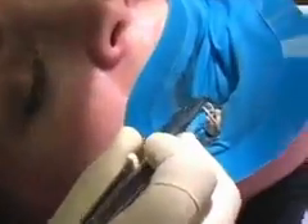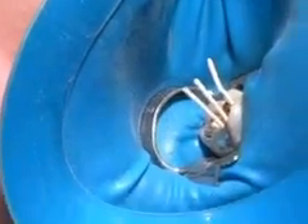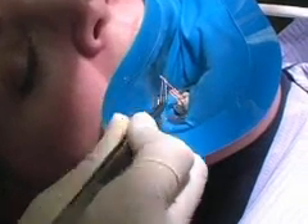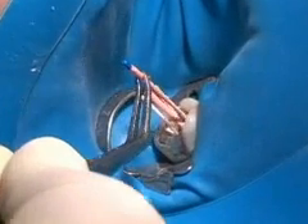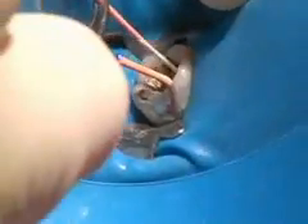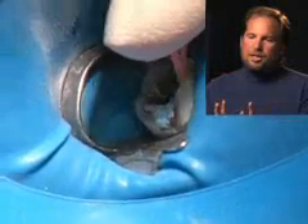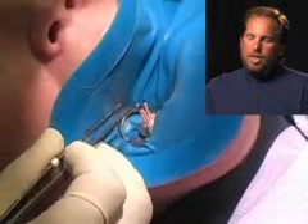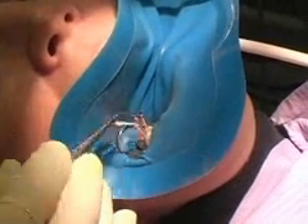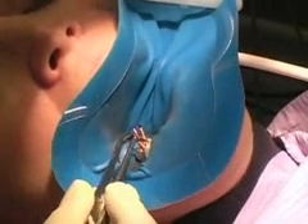Then we dry the root canal space using something called paper points. I've got them standing all straight up. When you see that the canal is shaped so all the paper points are standing straight up, that gives you a good indication that the root canal is shaped properly. You like to see both the gutta-percha points — these rubber points we're putting in now — and the paper points standing straight up, which indicates a very well-prepared canal. We've got all four standing up straight, and that looks good.